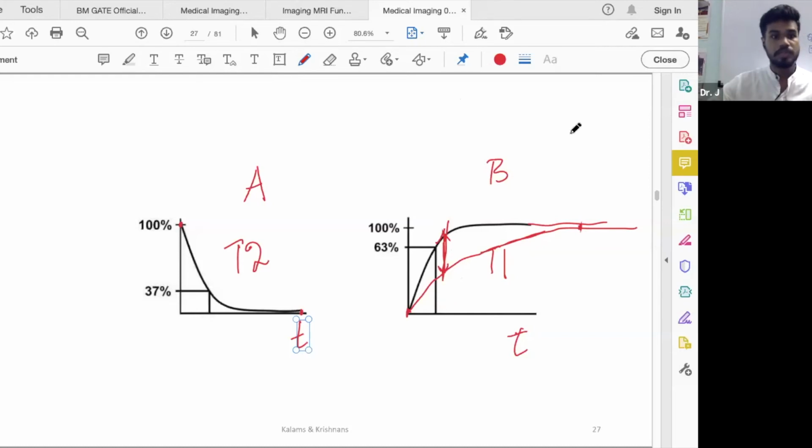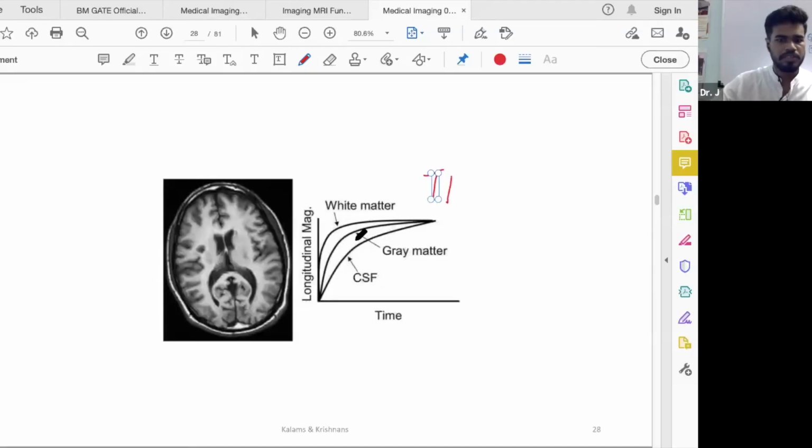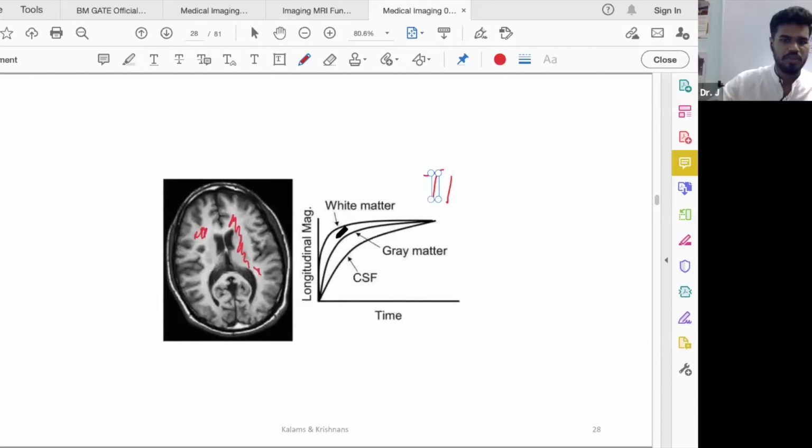Okay. Now let's actually see what is the case, again schematically, for the tissues that you mentioned. So what I have here is it goes back to the original. This is T1 relaxation. White matter is pretty fast. It goes really, really fast. Where is white matter over here? This white, light region, all this region is white matter. It goes really fast, so its intensity is more, white.